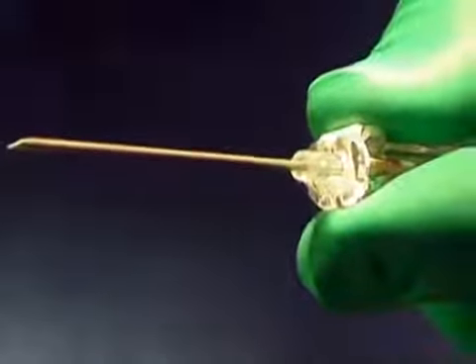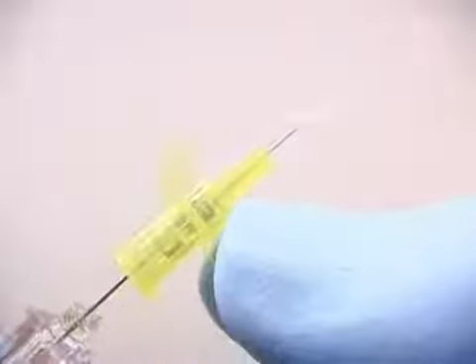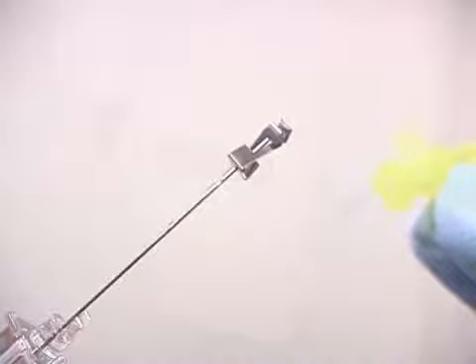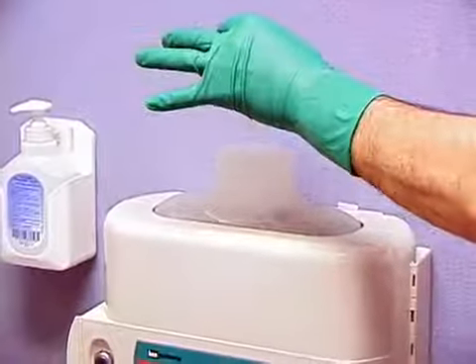Some catheters are equipped with a spring-activated retractable needle. Others have a protective clip that covers the needle as it is withdrawn from the plastic cannula. Needles should always be discarded appropriately in a sharps container.